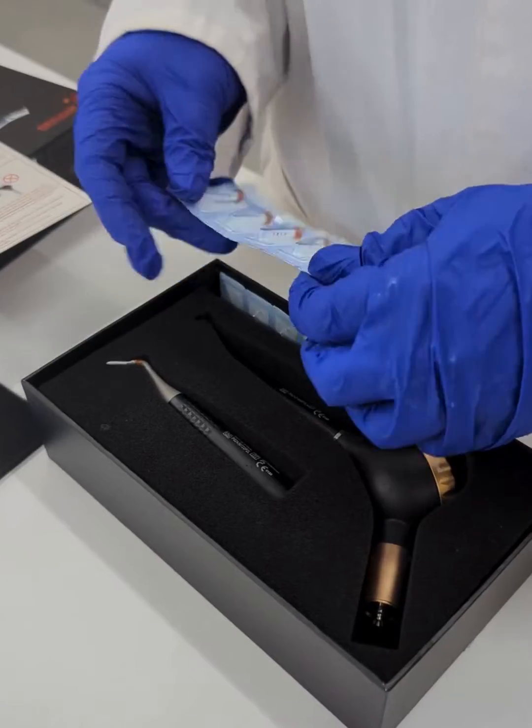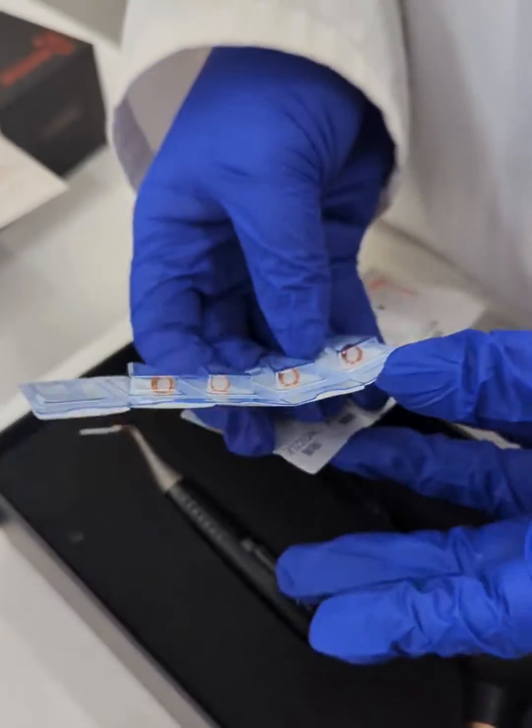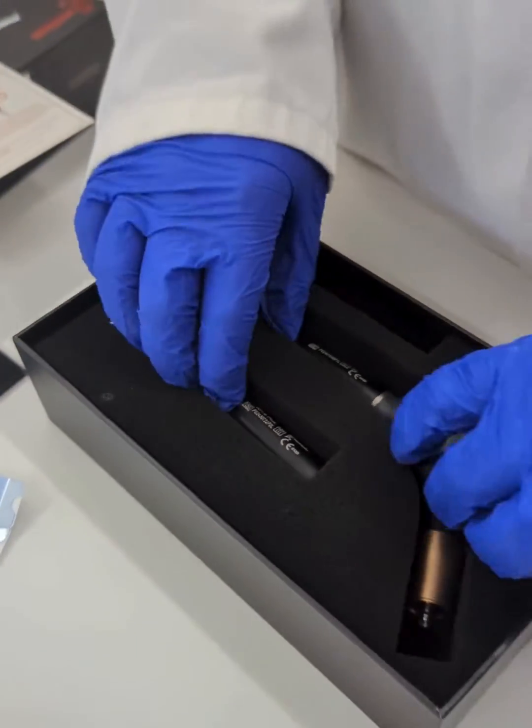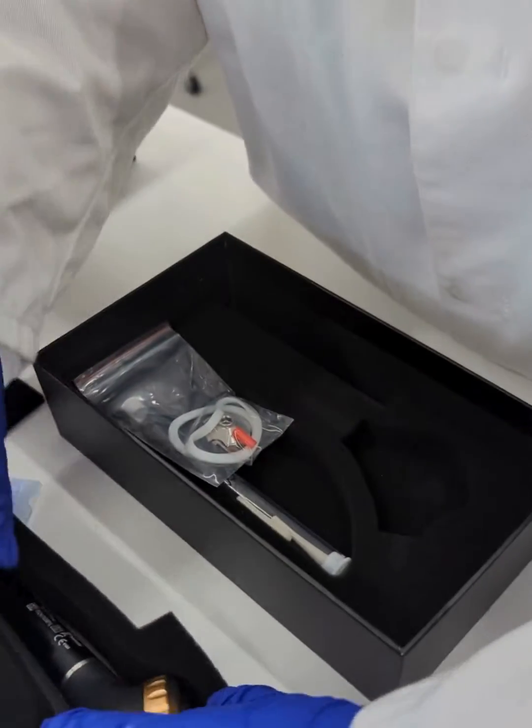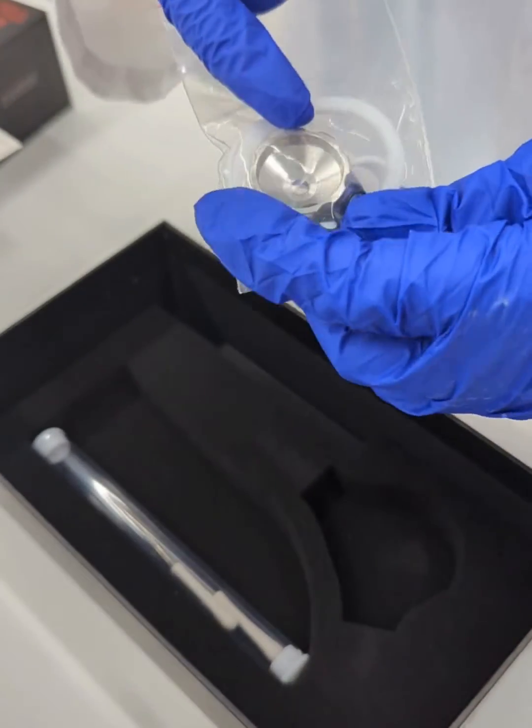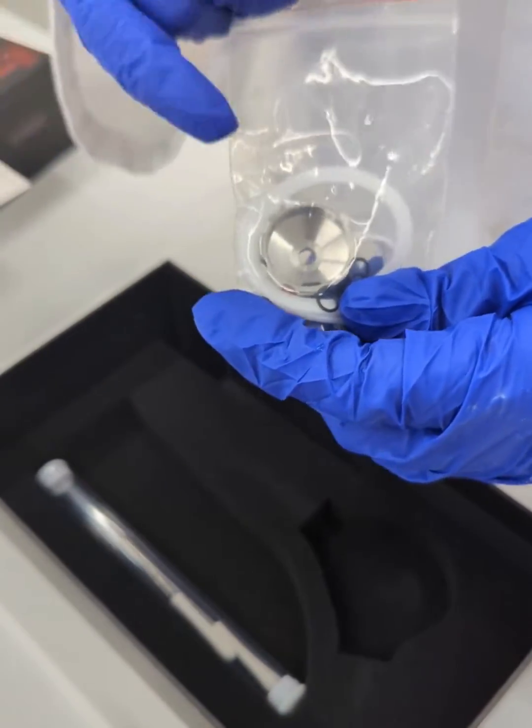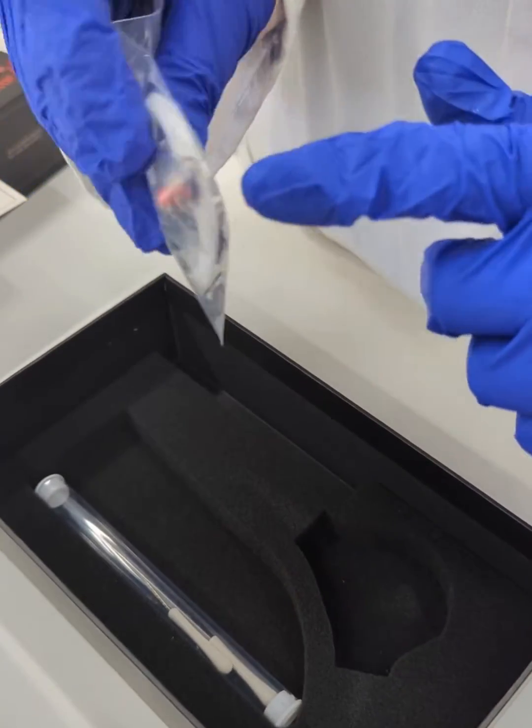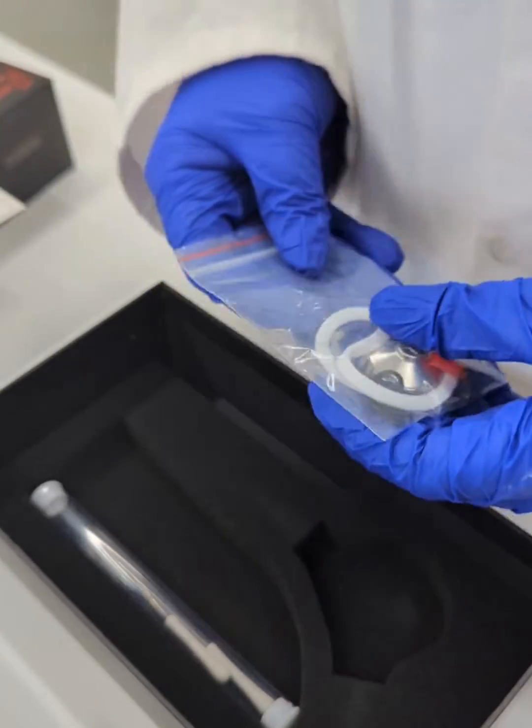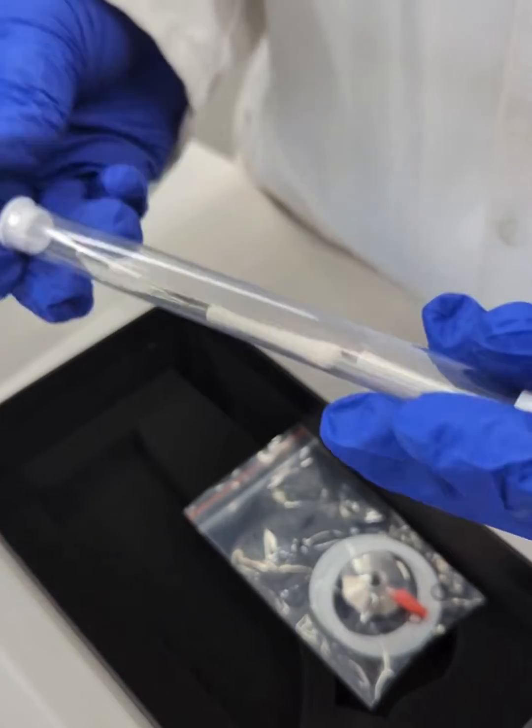You also get the replaceable tips here in the box. And underneath this, you also get the metal tip tightener for the perio and plenty of spare o-rings for the handpiece if you have any leaks and some cleaning tips as well.